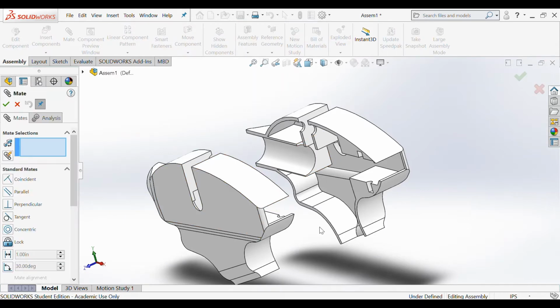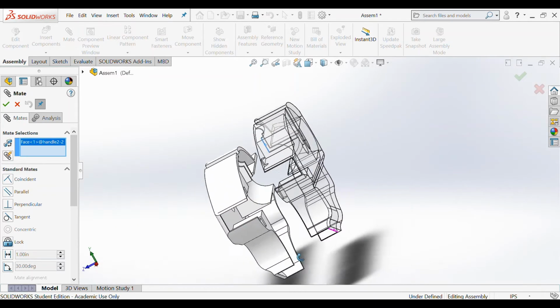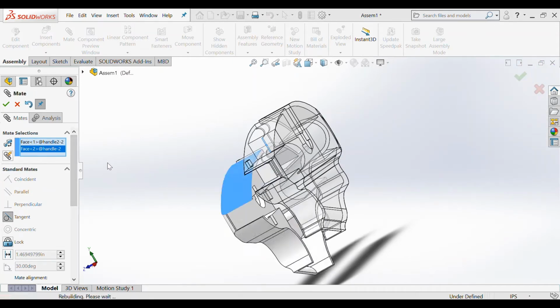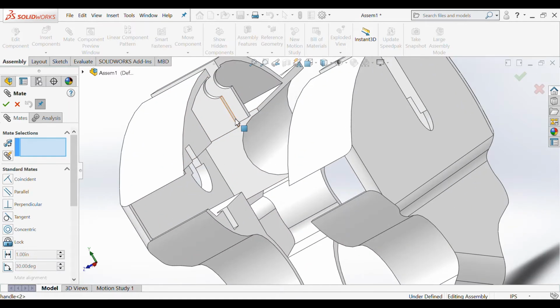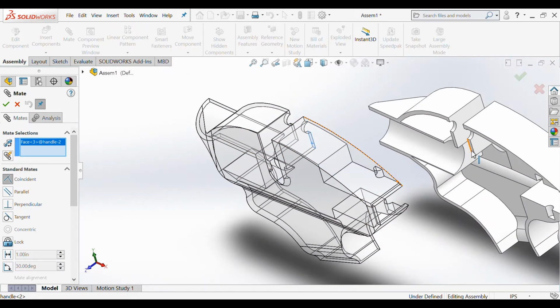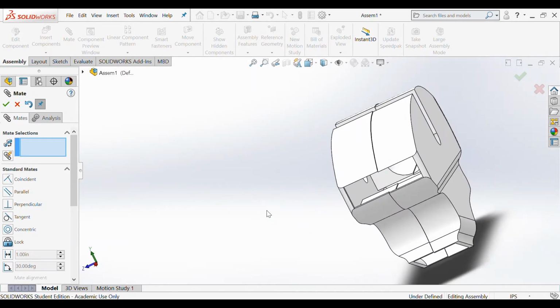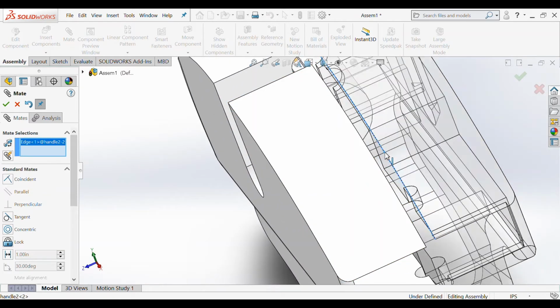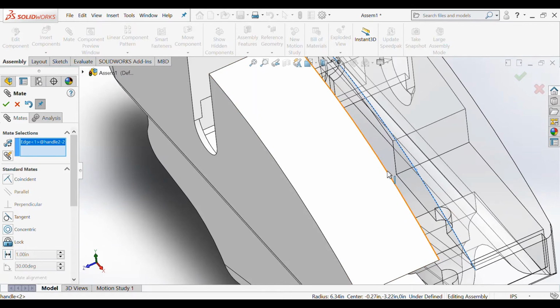And to put these two pieces together, I'm going to go on ahead and click on this face right here, and that same face on the other piece. Right there. And I'm going to go ahead and make that face and this face coincident. Next, I'm going to make this curvature on this side of the handle and this curvature on the other side of the handle coincident as well.